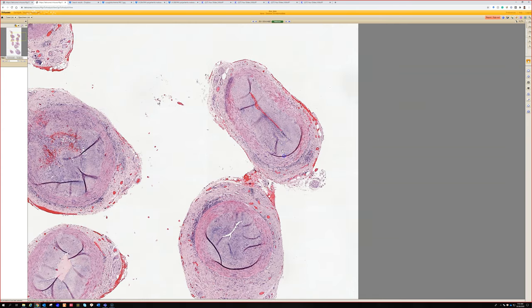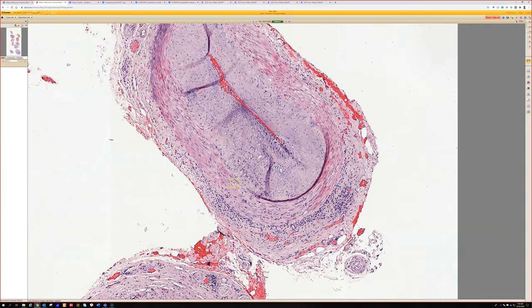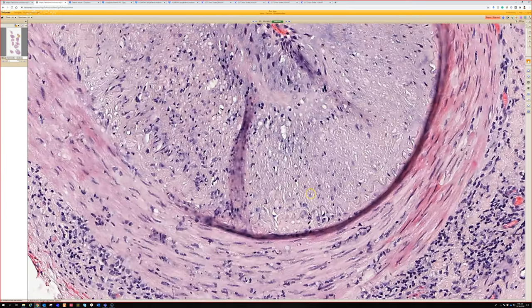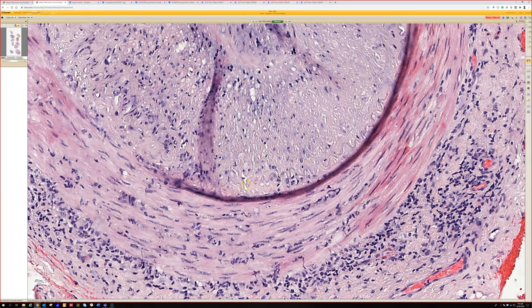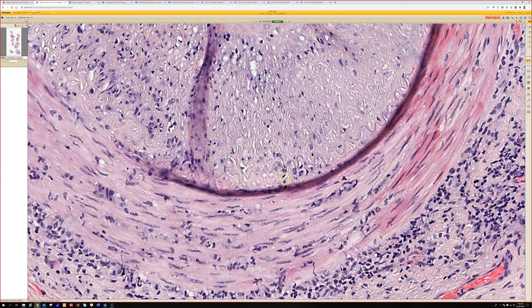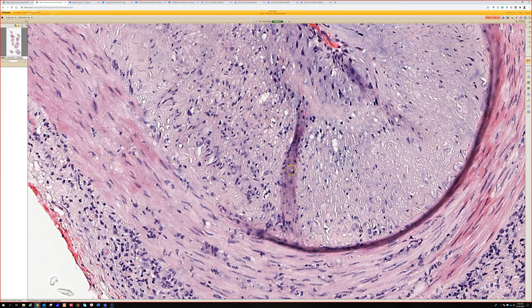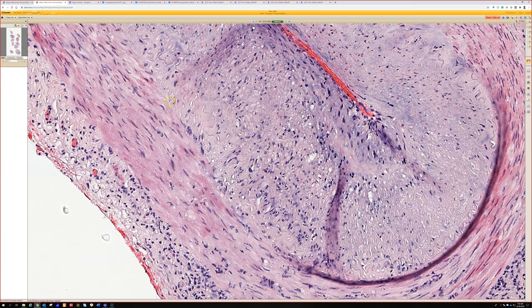When dealing with an artery, having a real thick, well-formed muscle around it is probably an artery — although veins can have thick muscular walls too. The best thing is looking for a nice thick internal elastic lamina. See this little squiggly band here? It's a lot easier to see on a light microscope — because if you flip the condenser, this is kind of a three-dimensional structure. Flipping the condenser makes it stand out and look kind of refractile. A lot of people like to do VVG — Verhoff Van Gieson elastic stain. I honestly feel like most of the time I can see the elastic lamina just on H&E.